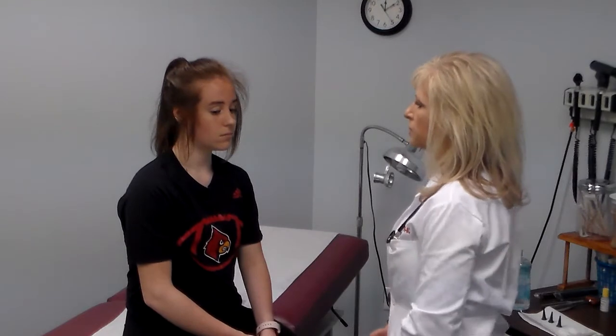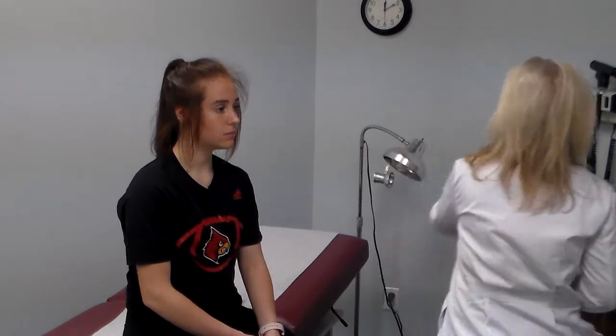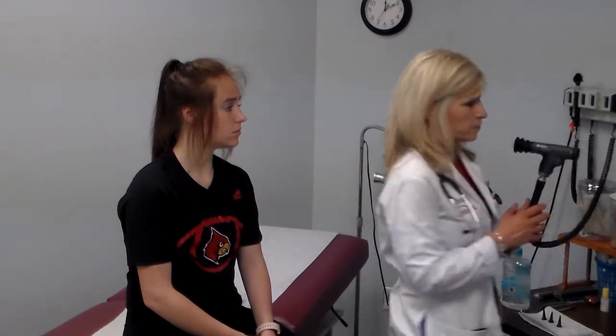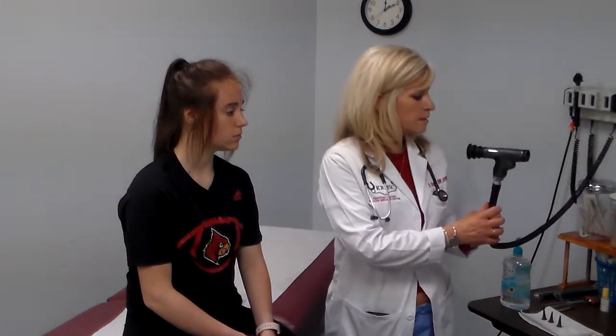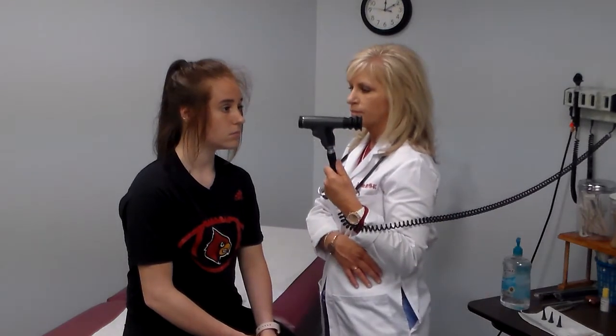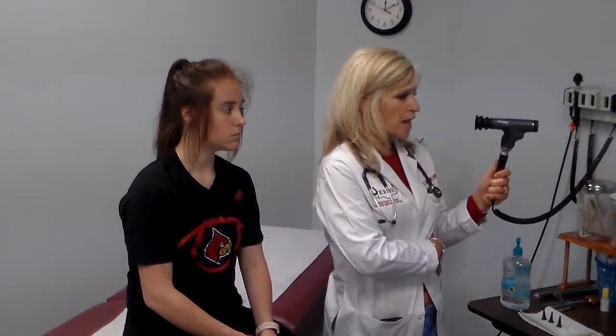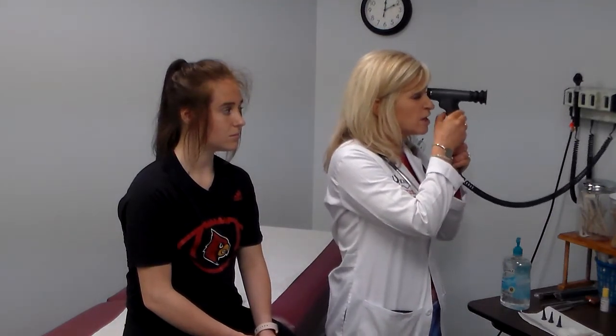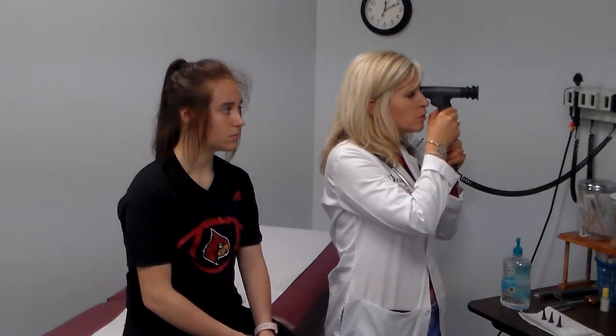Lastly, you're going to perform a fundoscopic or retinal examination. You're going to examine both sides using the ophthalmoscope. You're going to hold and position the instrument correctly, the left hand to the left eye. And then you're going to calibrate the ophthalmoscope by finding an object on the wall about 5 feet away from you, and then adjusting the parameters until it's no longer blurry.